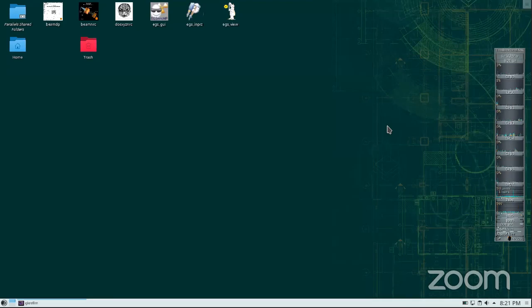So I told you, okay, the PDD for 6 MV is 66 plus or minus 5%. So it could be 71. This is my measurement. No. You're not going to accept this, right? But if I told you, okay, I have my PDD, I know this within, let's say, 1% or 0.5%, this is an acceptable PDD for measurement, you're accepting that. That's fine. When you do the simulation, you also calculate the PDD curves to the uncertainties that you accept.